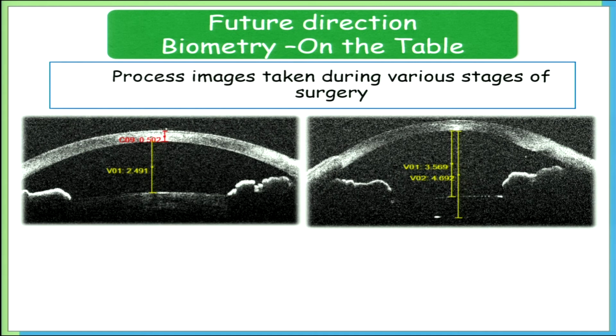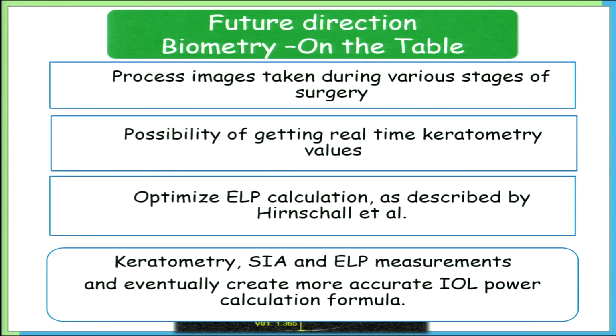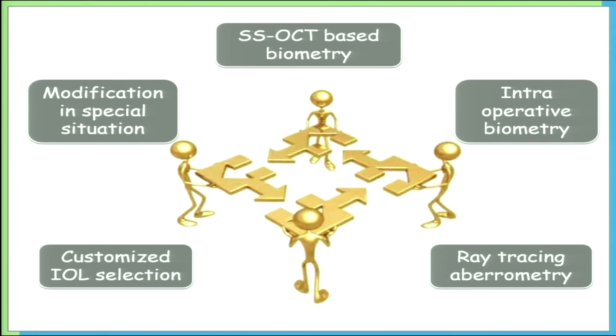Lastly, I would like to say this is the future of biometry, where we can do intraoperative OCT, and it will definitely decrease the IOL prediction problems. But this technology is again demanding, and it is a little manual, not very automated. And other problems, as I said, are vitreous hydration, and iris-capsule contact needs to be separated in such cases. In the end, I would like to conclude by saying that with modern measurement techniques and better formulae, hopefully in future we'll improve the prediction and achieve better ELP and axial length as well as keratometry. Thank you so much.